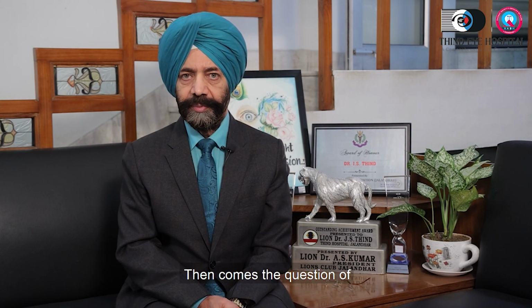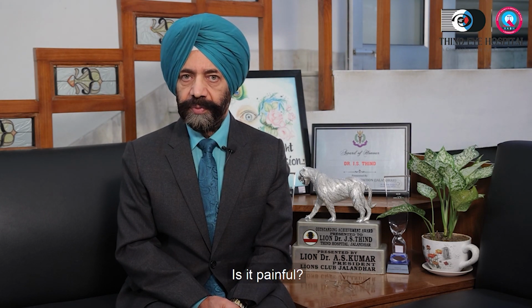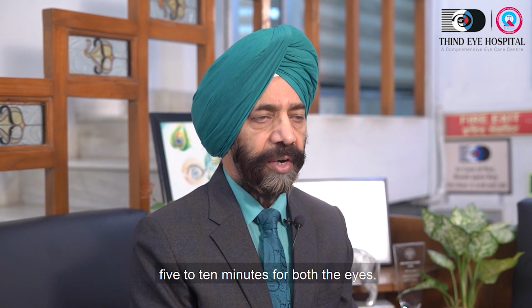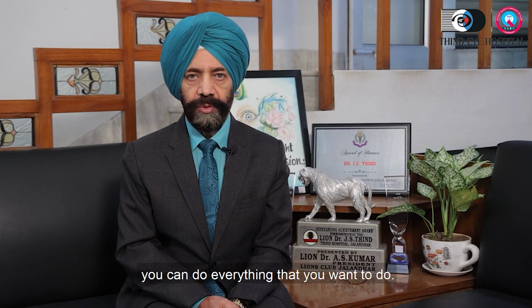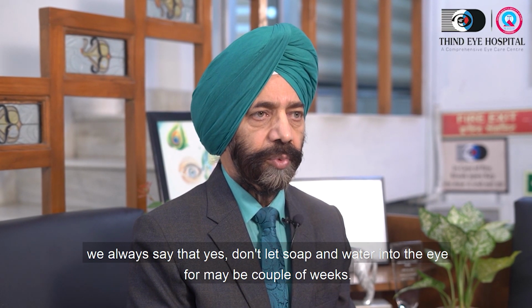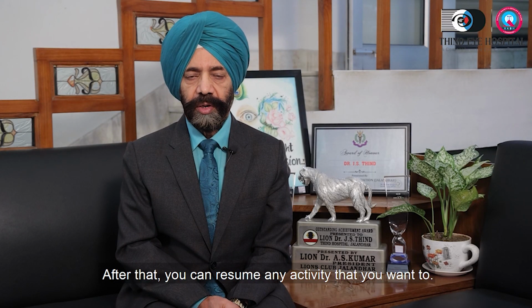Then comes the question of how much time it will take. Is it painful? What is the recovery time? If your eye is fit for ICL, the procedure takes hardly 5 to 10 minutes for both the eyes, and the next day you can resume your normal work. In a couple of days you can do everything that you want to do. And we always say, don't let soap and water into the eye for maybe a couple of weeks. After that you can resume any activity that you want to.